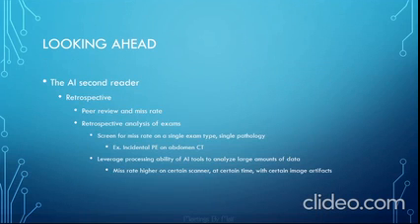Another role that AI applications could play in the near future is that of an AI second reader. When you think about a second reader, you may envision an application that highlights findings on an exam and makes the interpretive process easier for the radiologist. This fits the model of several current commercially available applications, notably the computer-aided detection type of tools, or CAD. But this AI second reader can also play a broader role in the peer review and quality assurance process.